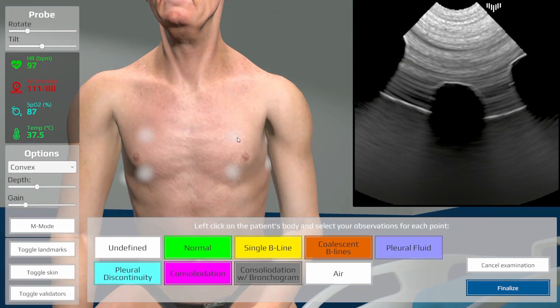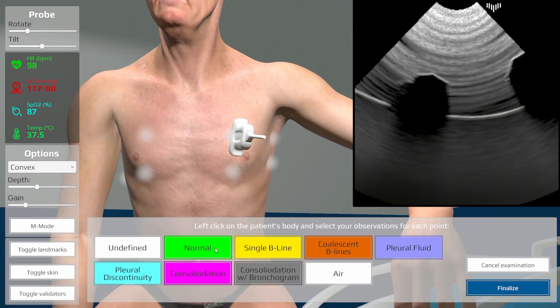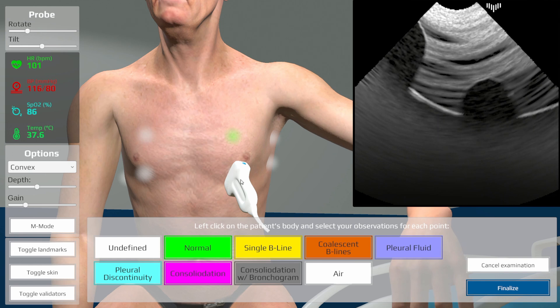The patient automatically lifts his arm when the probe approaches an axilla.